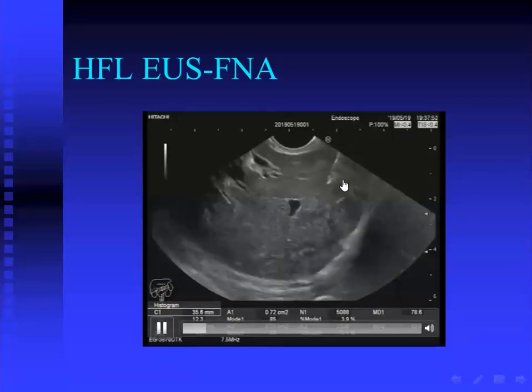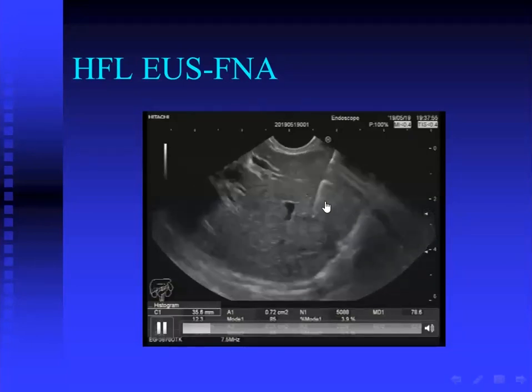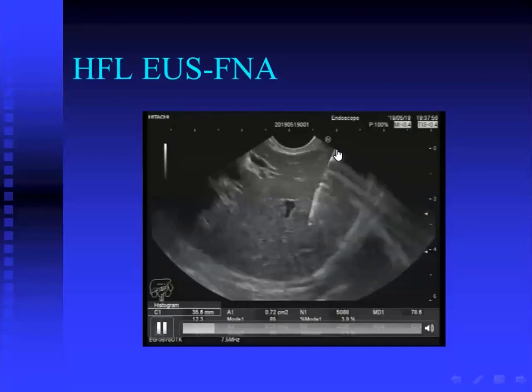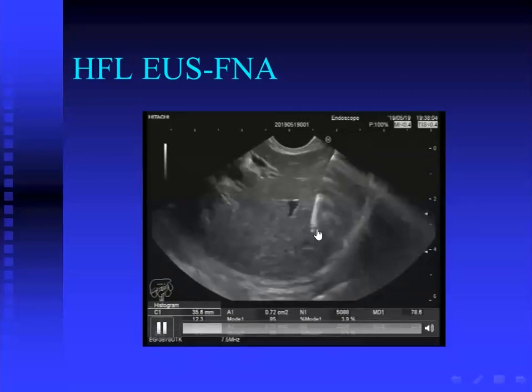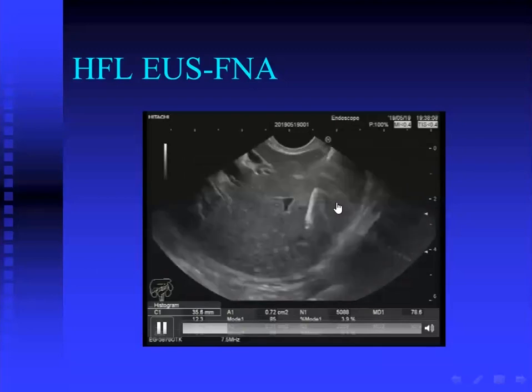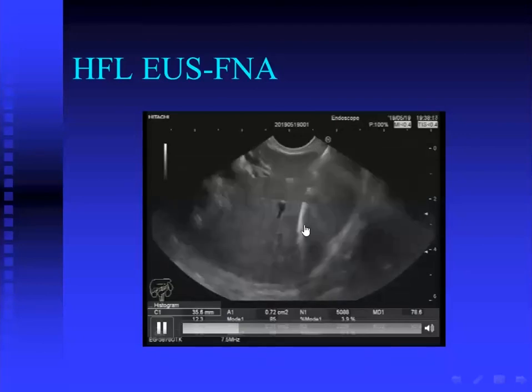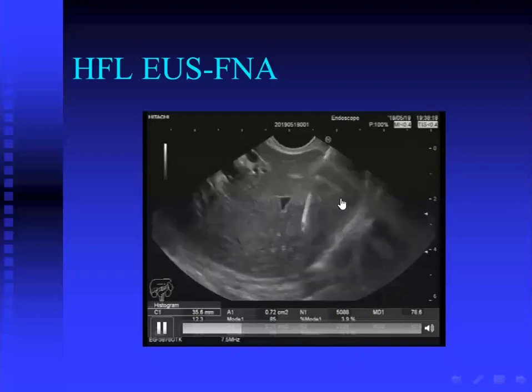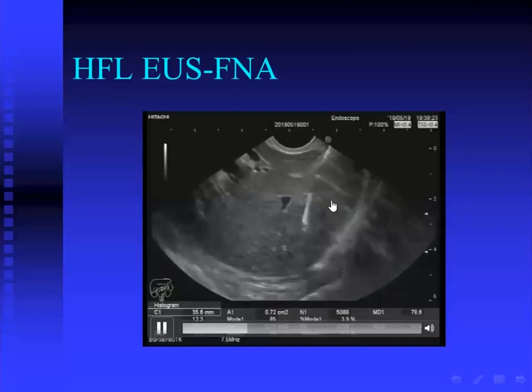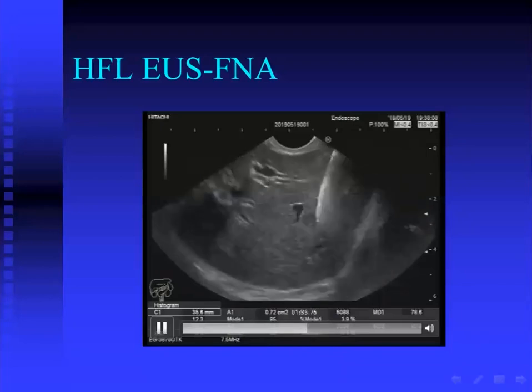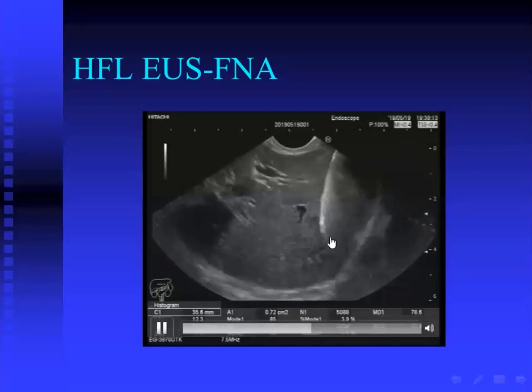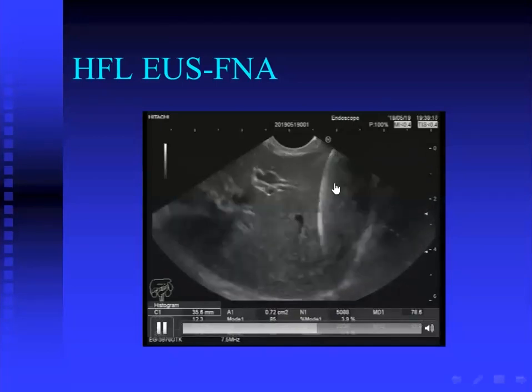During endoscopic ultrasound, it is very easy and very safe. I enter through liver tissue and monitor throughout the whole course of the needle. I can introduce the needle into the focal lesion, controlling it and not allowing it to bypass and go to the diaphragm, pleura, or lung — it moves only inside the hepatic focal lesion. This lesion is very easy to access, although it is away from the echoendoscope, because the course of the needle is very safe with no intervening important structures.